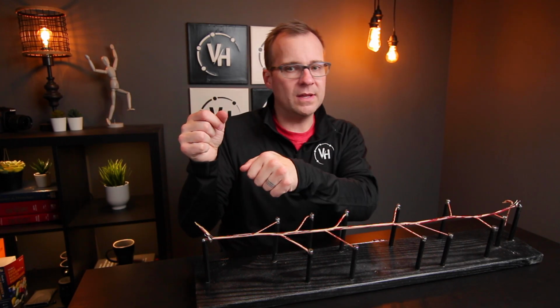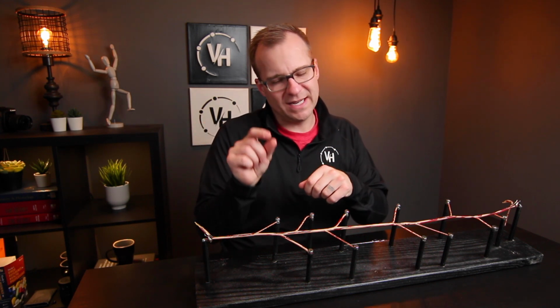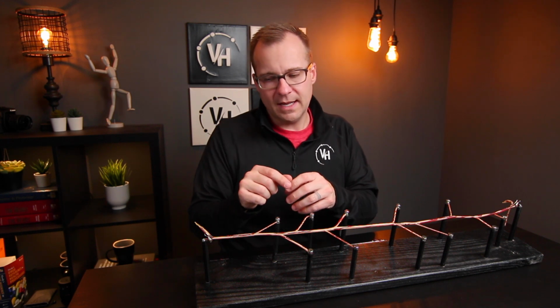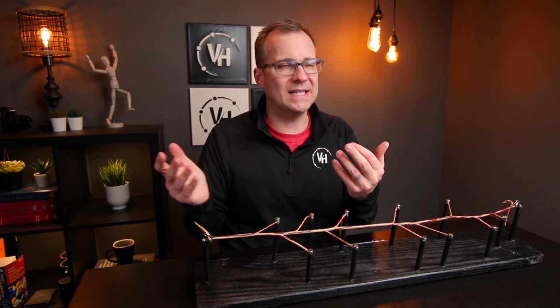You do have to be careful as you get close to the knee just because of how much skin is moving at the knee. But if you have an issue and you can't quite get to that tissue, it's going to be better for the conduit if you open up that incision a little bit further to free that up rather than pulling that conduit down to get at that extra tissue. So extend your incision just a teeny tiny bit, and if that's not enough, a little bit more. Just keep it away from the knee joint itself, and you won't have any real downside to doing that.